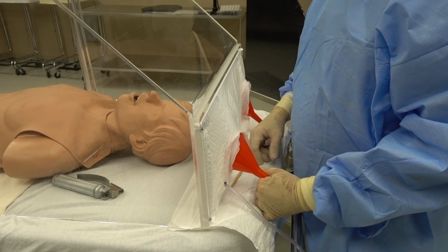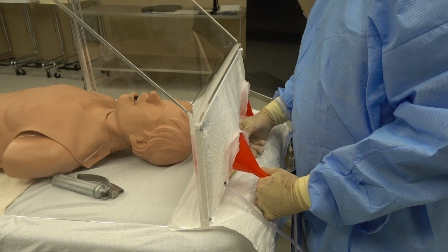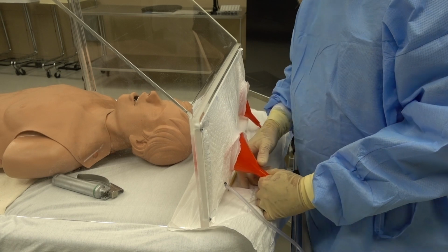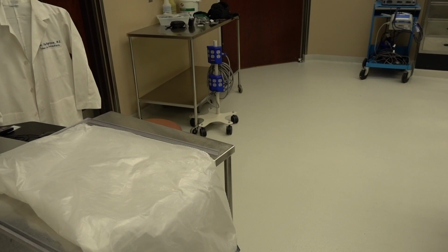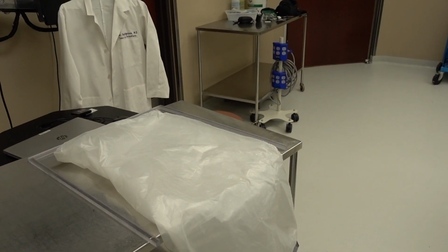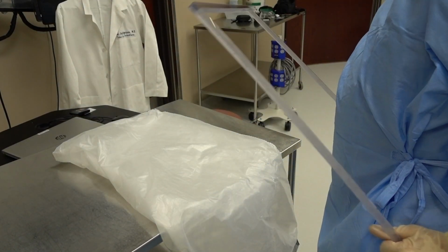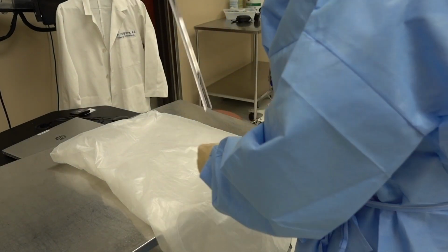You can get these bags for, I've seen them as cheap as $20. All this is a 13-gallon kitchen bag, and it works beautifully. The back bag that we use is a bag that they use here at the hospital to dispose of everything after a case. And so that ring is bigger, and it has to be open at the bottom because it lets the patient go through it. So the bag's around them like this, if you can see. So this is very easy to insert.